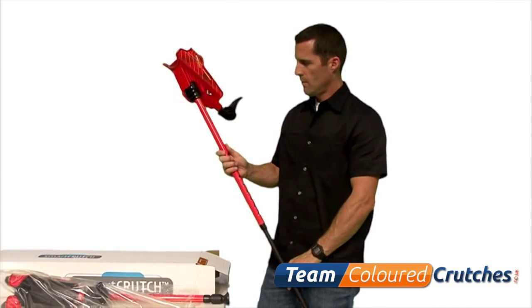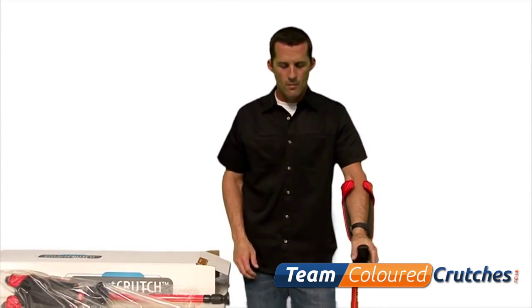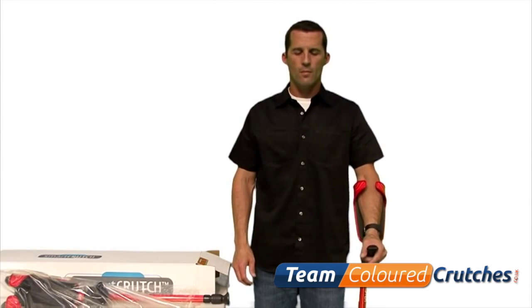Once the pin is set, place your crutch by your side. Slide your hand through the cuff and place your hand on the grip. Continue to make adjustments to the height until you find a position where your shoulder is in a neutral, comfortable position.